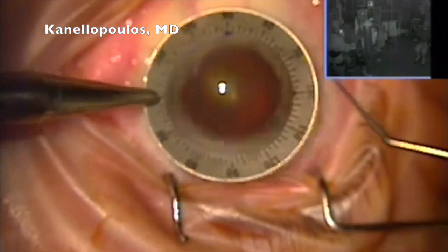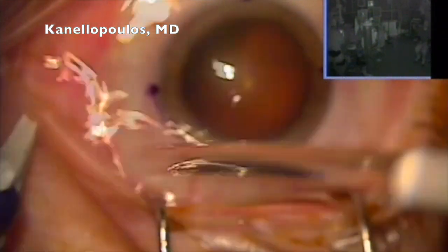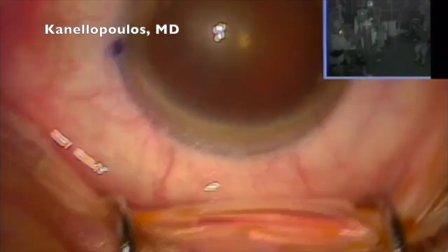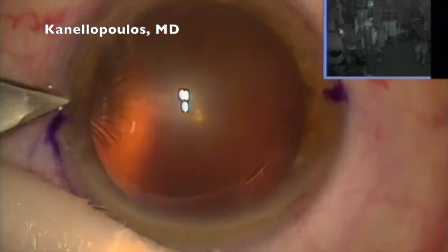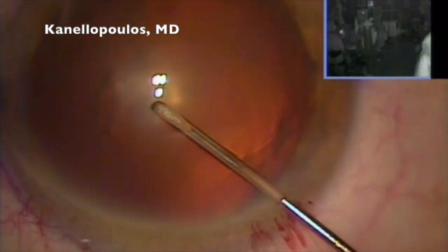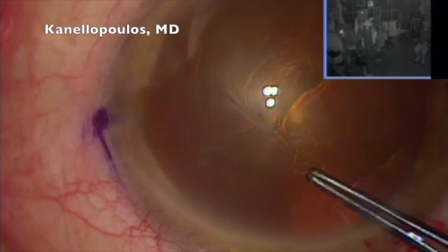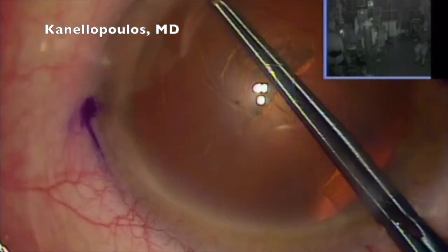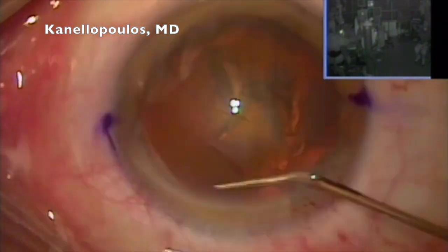Next patient, a T4 again. This is the against-the-rule day, I guess, today. Putting here our marks. Different patient, same story. We have a significant cataract here, incision at 135 always, and this is embedded in my IOL calculation protocol. A continuous curvilinear capsulorhexis. Again, very nice, centralized.